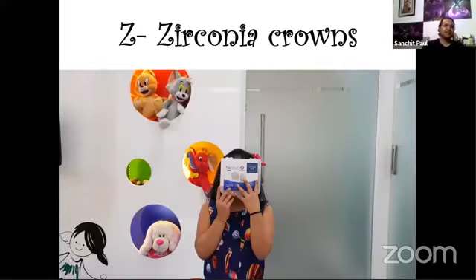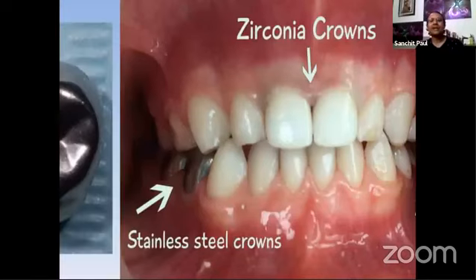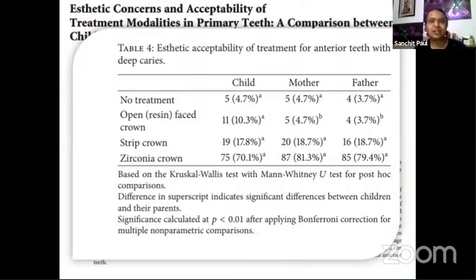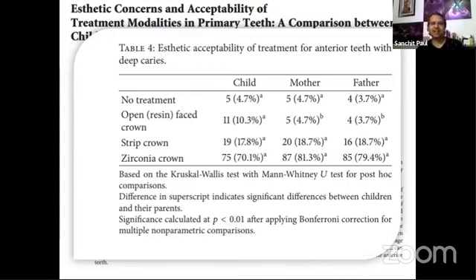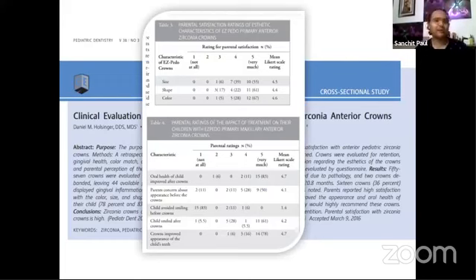Last but not the least, the Z is for the zirconia crowns. But this is something which I'm sure, as adult dentists, as general dentists, all of us are very, very well aware of. And I think most of you have passed out with monolithic zirconia crowns, and we are moving towards more of EMAX and lithium disilicate crowns. But trust us, for pediatric dentistry, this has been a huge boon, especially for primary anterior cases. And there has been a lot of literature which highlighted that it is readily accepted by the parent, by the child, and everybody loves it.